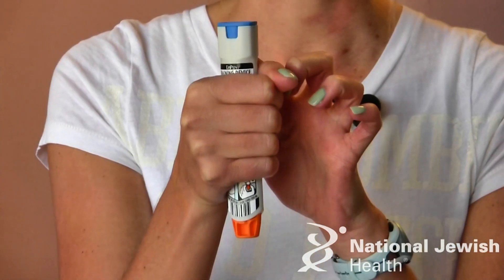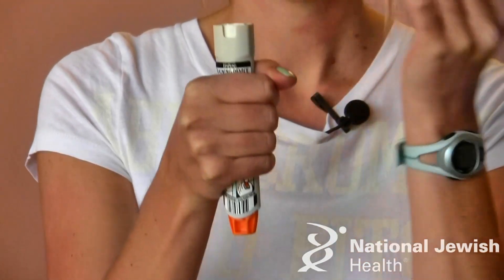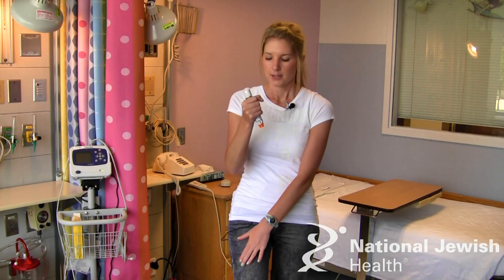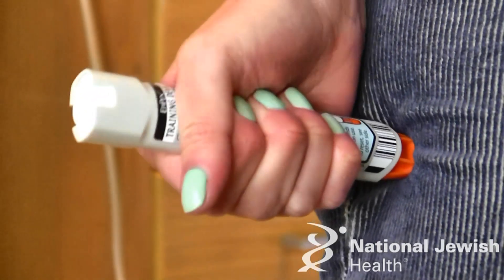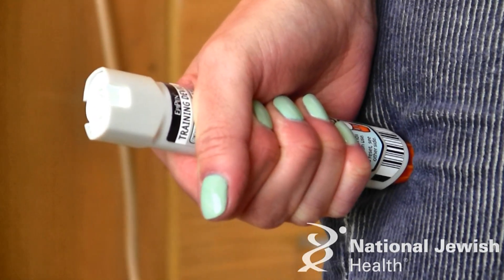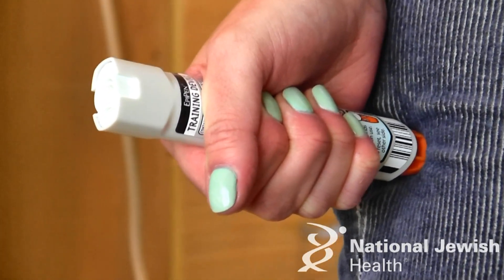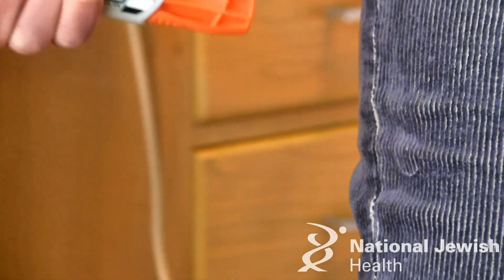In order to activate the EpiPen, you remove the blue cap and you will inject it into the lateral thigh, which is the big muscle on the outside portion of the child's leg. You hold it at a 90 degree angle and you insert until you hear a click. And you hold that click for 10 seconds. Most parents don't know that it's okay to use this through the child's clothing, so don't worry about trying to get their clothes off — you can just do it through their clothes.